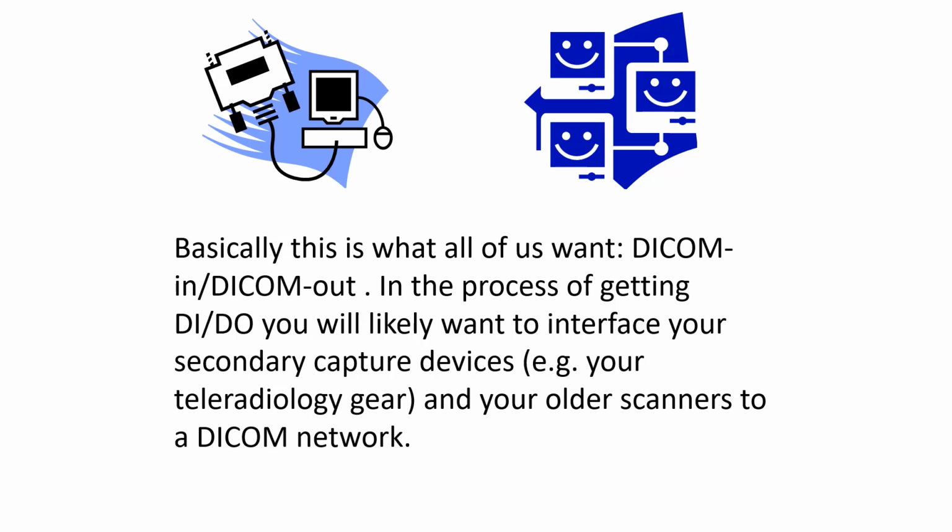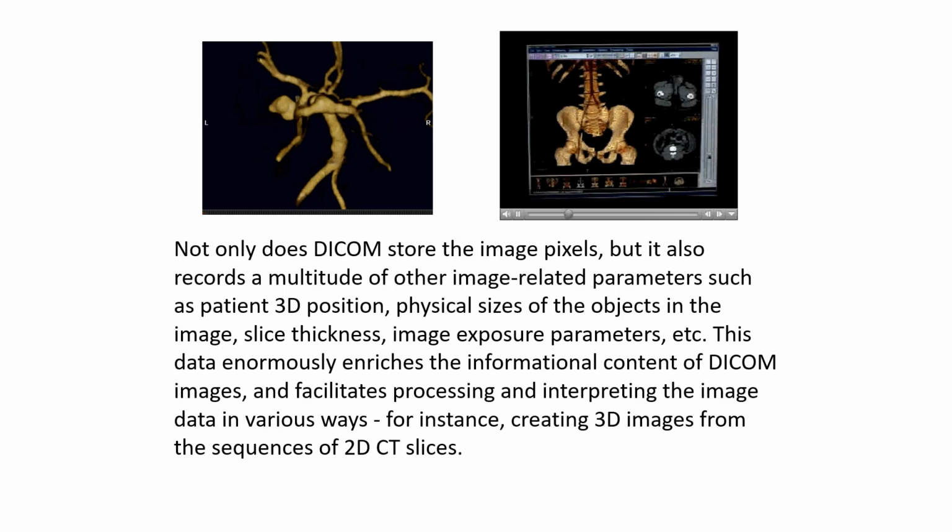In the process of using the equipment, how the equipment works and how it handles data is the manufacturer's proprietary system knowledge. We want to just make sure that the equipment receives DICOM data format and that the equipment, on finishing working with that data, puts out a DICOM data format.